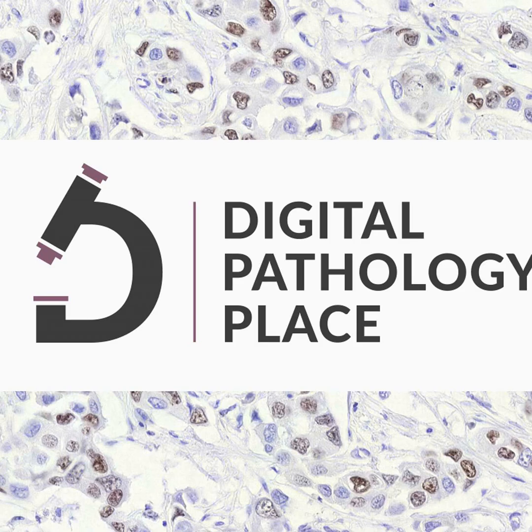And the last one, which tends to be the best solution, but only if you have the data, because this does require labeled images from your target domain, is you initially train your model on the source domain, but then you do what's called fine tuning on the target domain. So essentially you continue training it a little bit more on your target domain so that it can learn any unique characteristics of the target domain. But then you have a constantly evolving model. Right. Where you will need to fine tune it or train it more for each target domain that you're trying to apply to. Yes.